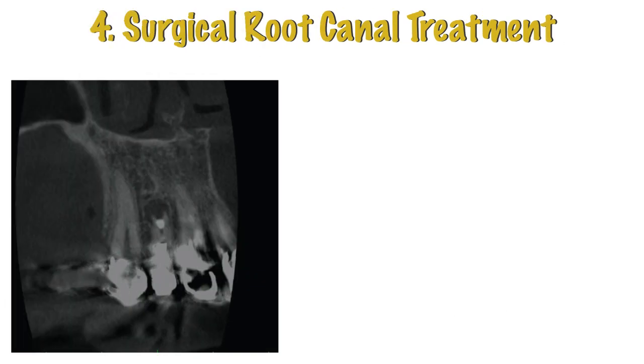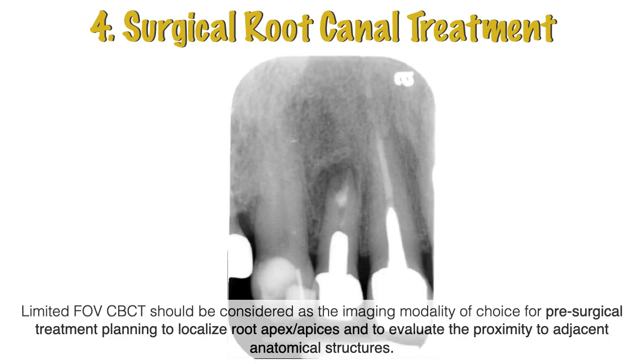It also helps clinicians to take their measurements on CBCT scans. When we're measuring something on a scan, it is extremely precise. It's different when we're doing this on a periapical radiograph. So let me go back, sorry. Tooth 1, 2, probably.